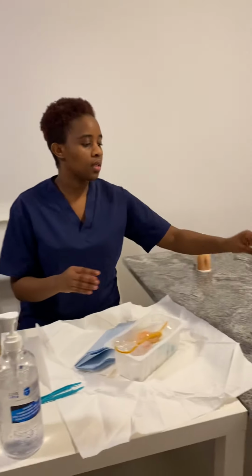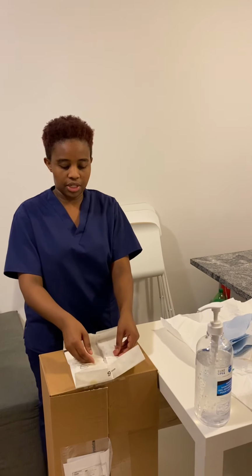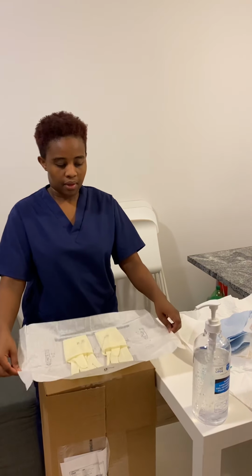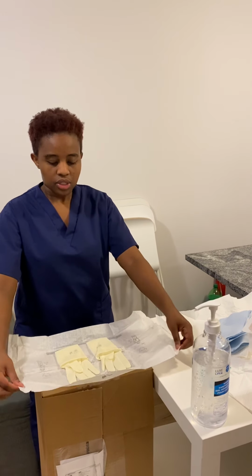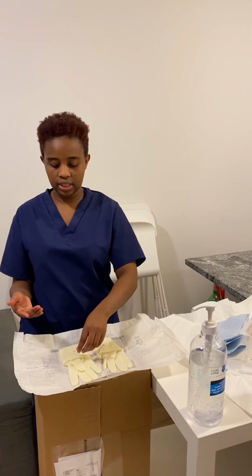Before putting on my sterile gloves, I have to sanitize my hands. Okay. So now I'm going to put on my sterile gloves. And I have to make sure that when I'm opening them, it's also away from me to avoid any contamination. With sterile gloves, I'm going to start with my dominant hand.